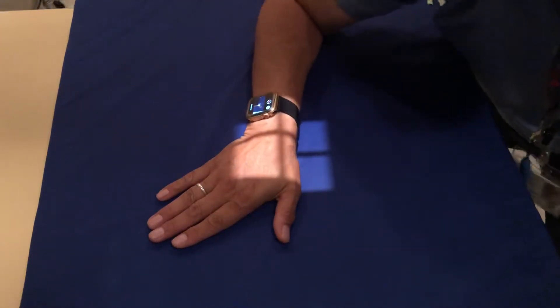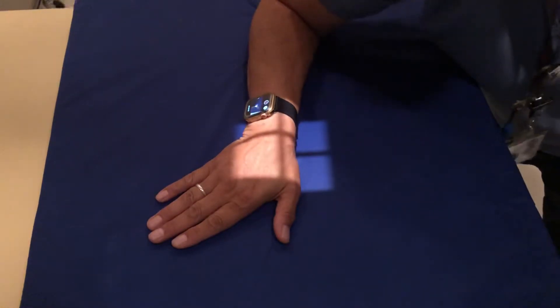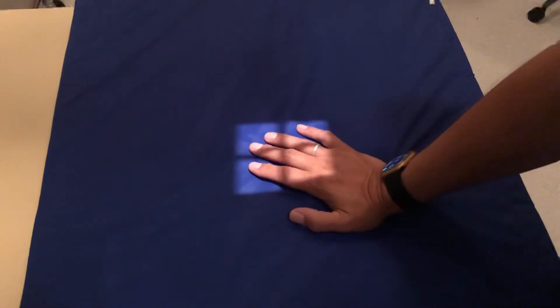Hi, you clicked on this link because you want to know how to take an x-ray of the navicular bone, or the scaphoid bone, and I'm going to show you how to do it perfectly every time. This is going to be an x-ray of the navicular or scaphoid bone.